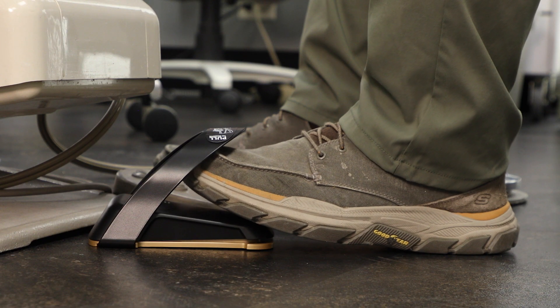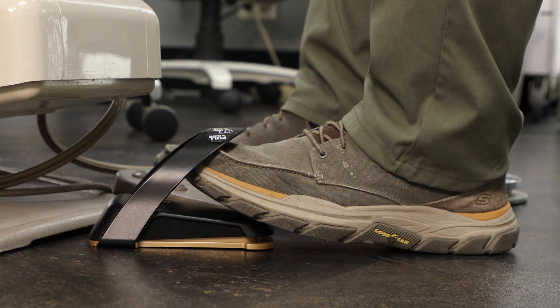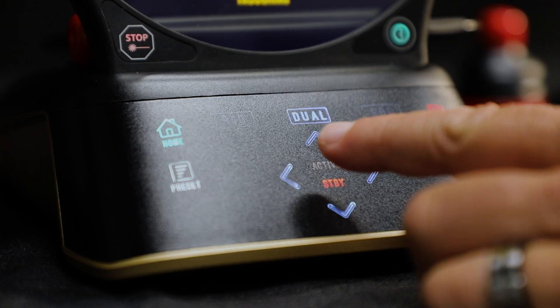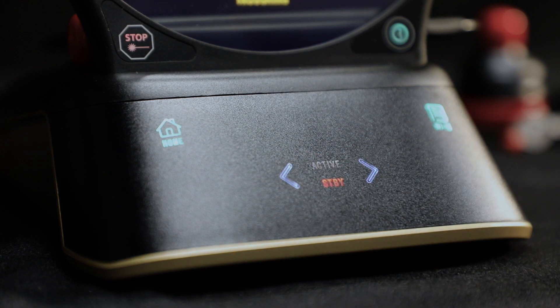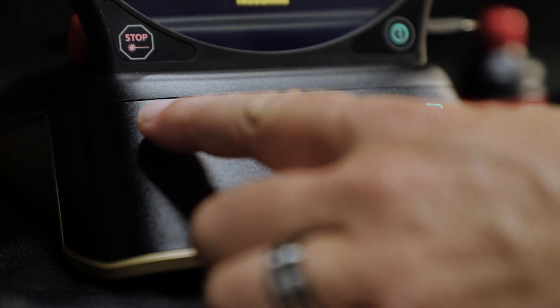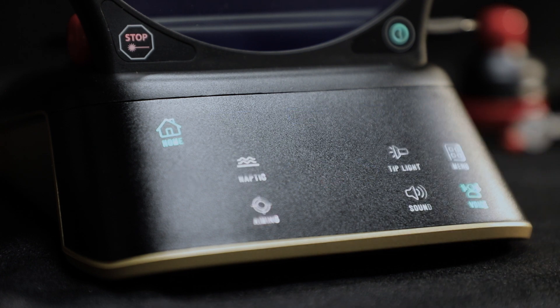If the activation pedal is released mid-treatment, the timer will pause and will resume when the pedal is depressed again. The unit is designed with Guided Touch Interface, or GTI. As you operate, the Gemini Evo only has relevant icons light up to help guide you through the interface and make proper input selections.